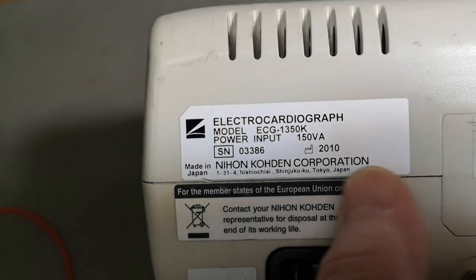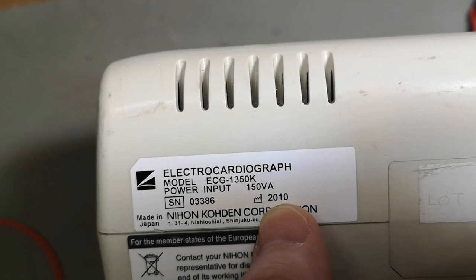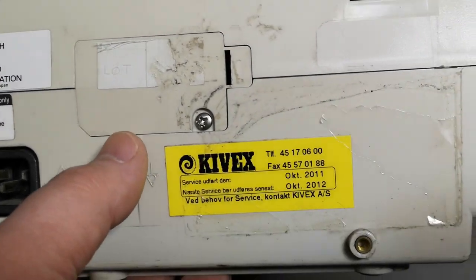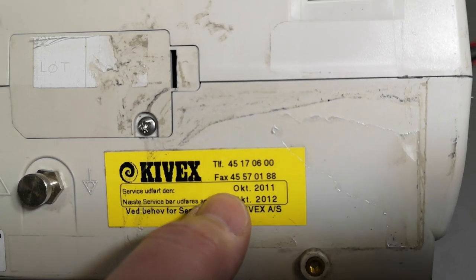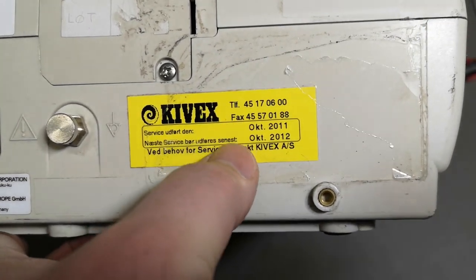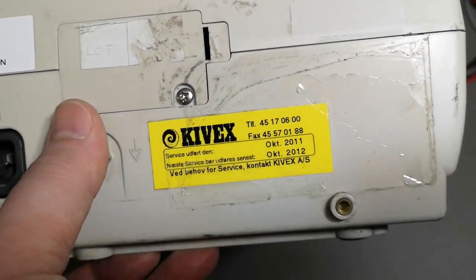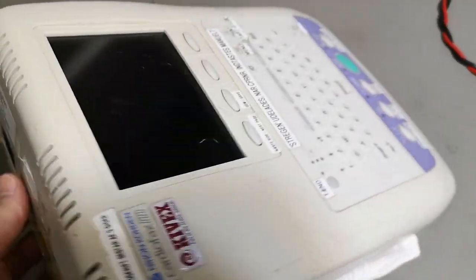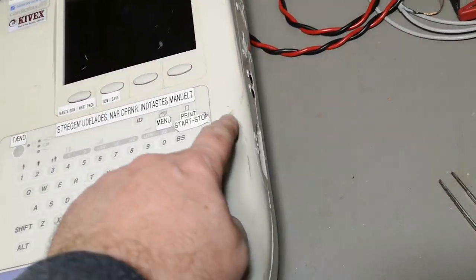Here we can see the model number, manufacturer name, and all that kind of stuff — including a little factory logo. Since this is a medical product, you need to see service records: manufactured in 2010, next service 2012. There are some other labels here of a similar age, so probably something was wrong with it, or it couldn't be serviced, or they got newer and better models.